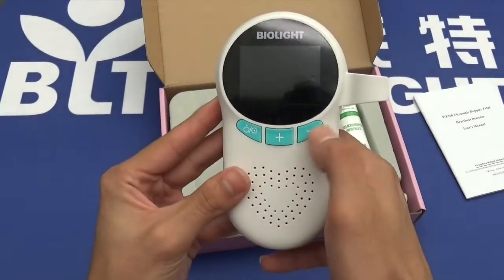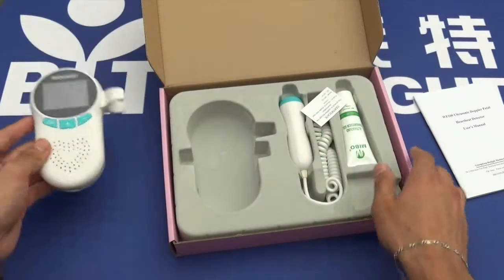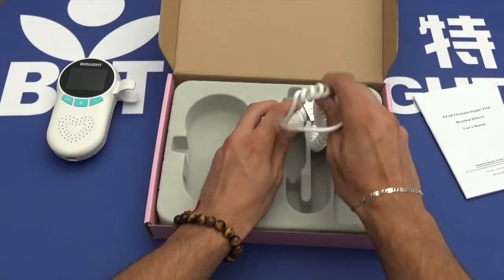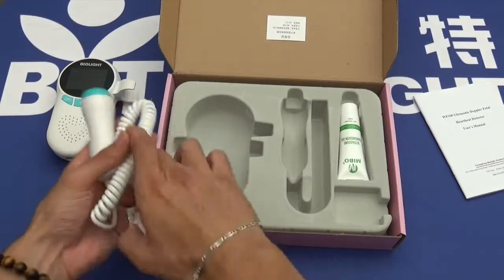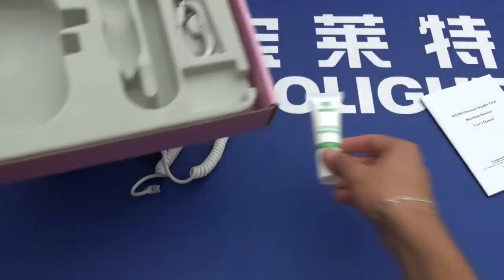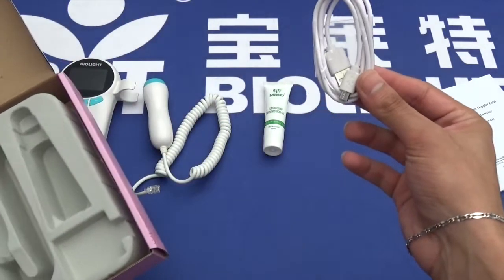There are three buttons on the front: these two are for the volume, and this button on the left is the on/off button. We have the ultrasonic Doppler, which actually detects the heartbeat. We also have the ultrasonic transmission gel, and finally a charging cable — it's USB to micro USB.